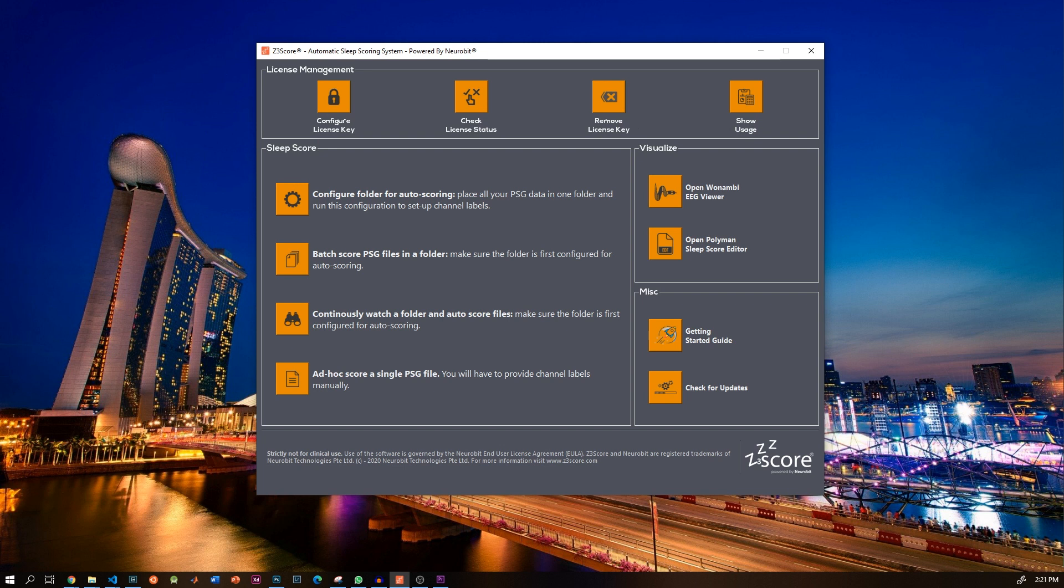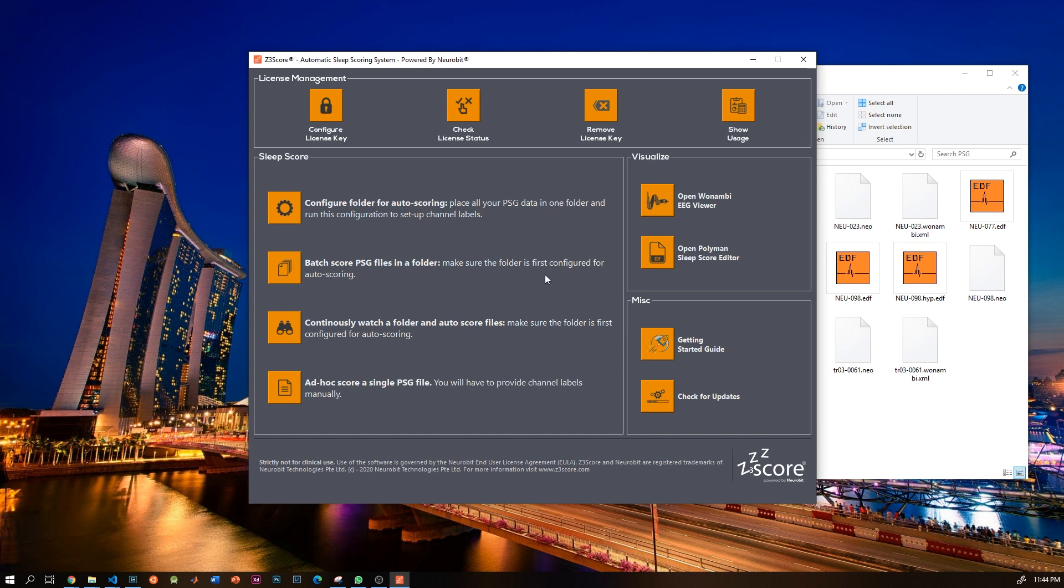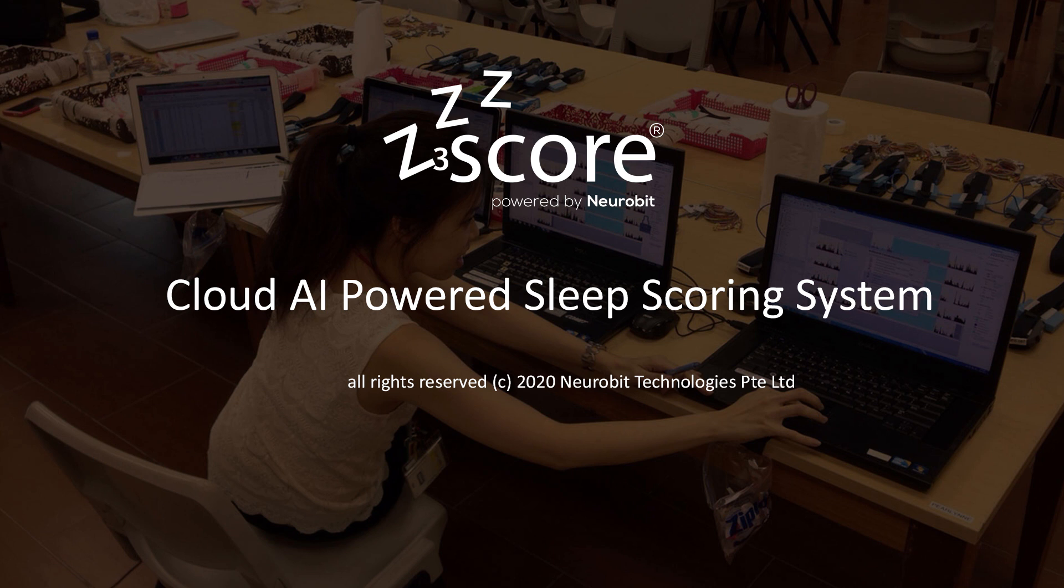Finally, you can click the getting started button to open this latest tutorial, and you can check for new updates at any time using the check for updates button. I hope z3score improves your sleep scoring workflow. Do not hesitate to contact us anytime if you have any questions or suggestions. Thank you.